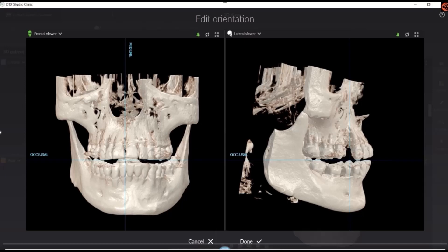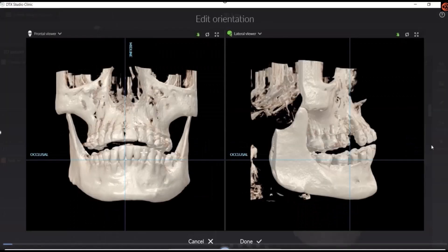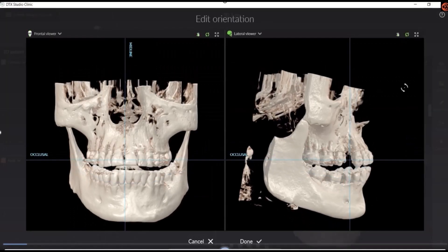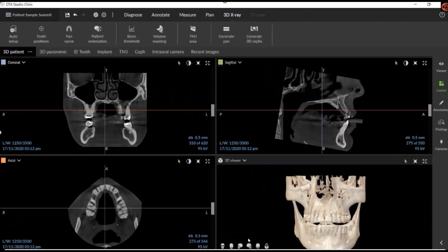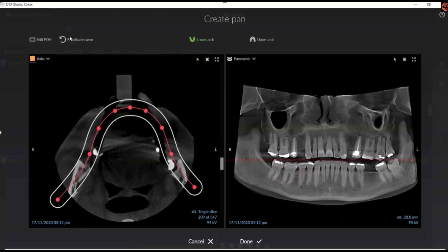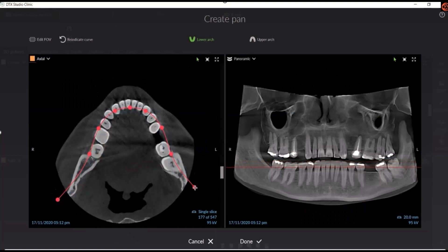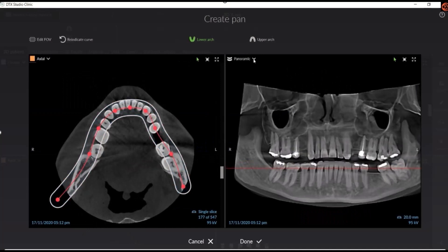We're going to see in this video patient orientation. We position the patient's head to adjust for any positioning errors and to ensure we are measuring accurately. We can also extract a 2D pan from a 3D image — we do that by creating a focal trough.